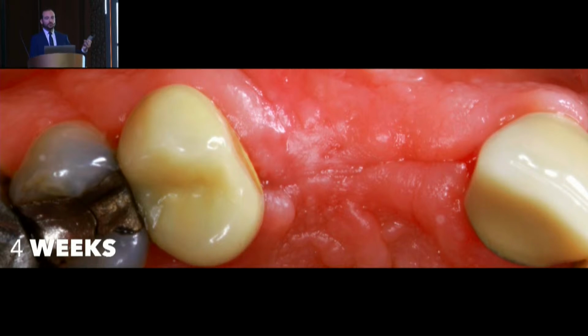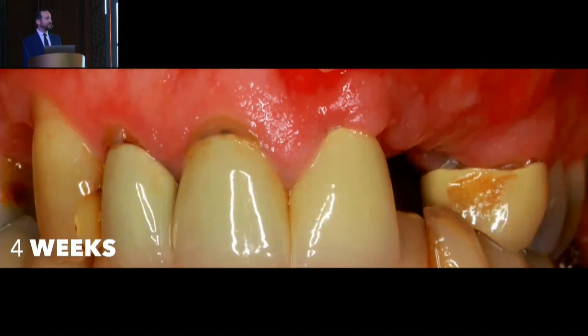We already created new space. We already put our biomaterial, our membrane, very stable. It's not moving. We obtained primary closure. So it's just a matter of time until we can perform re-entry to see the results that we have obtained.